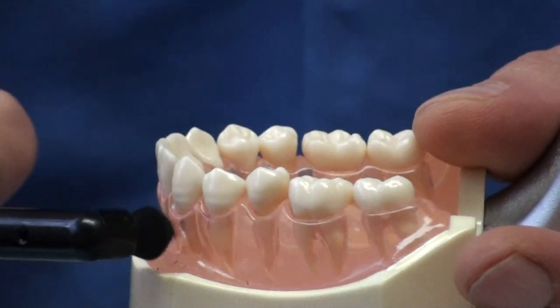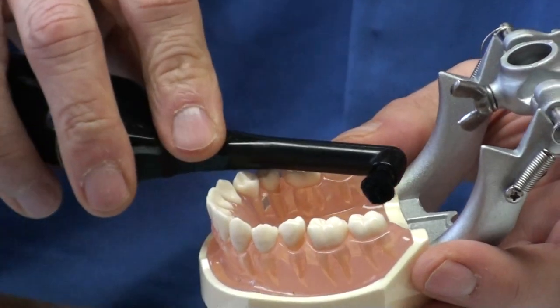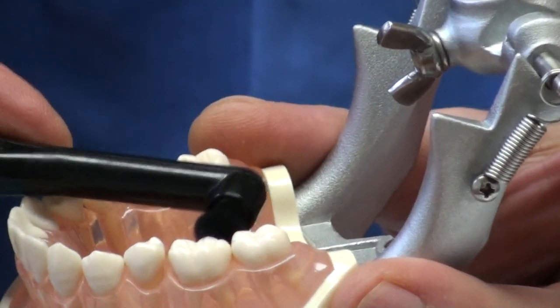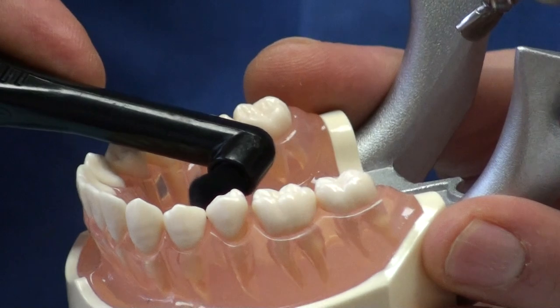For cleaning the insides of the teeth, you can use the teeth on the opposite side to hold the Rotodent steady. Then turn it on and come around. And that makes it a little bit easier.